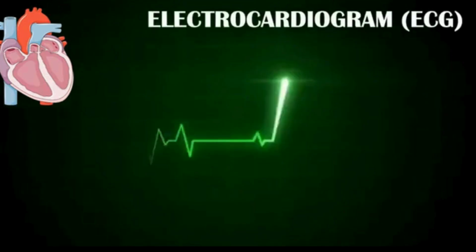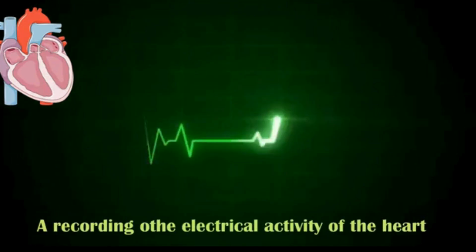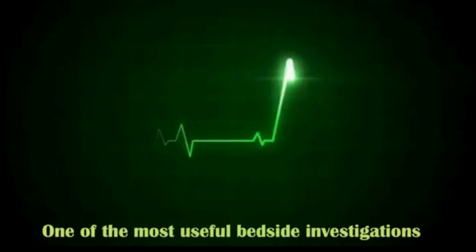An electrocardiogram, or ECG, is a recording of the electrical activity of the heart. It is one of the most useful non-invasive bedside investigations for the diagnosis of many cardiac-related diseases. Some common indications of an ECG include the following.